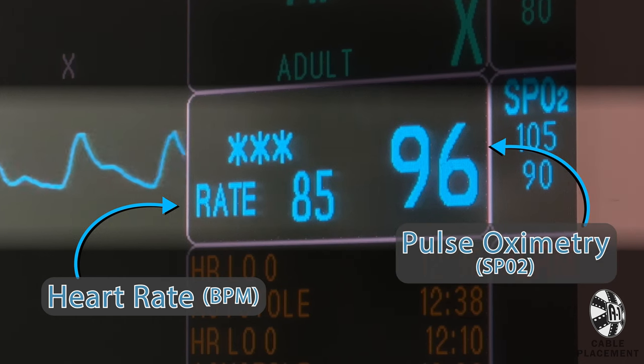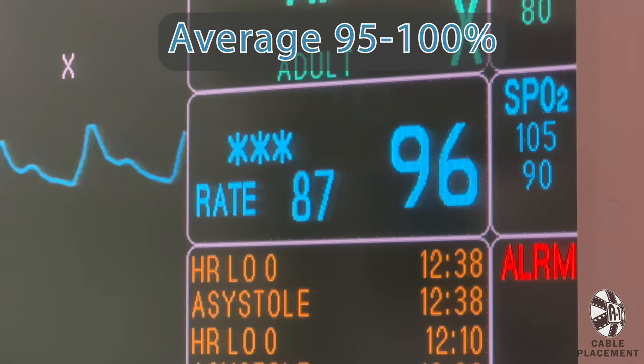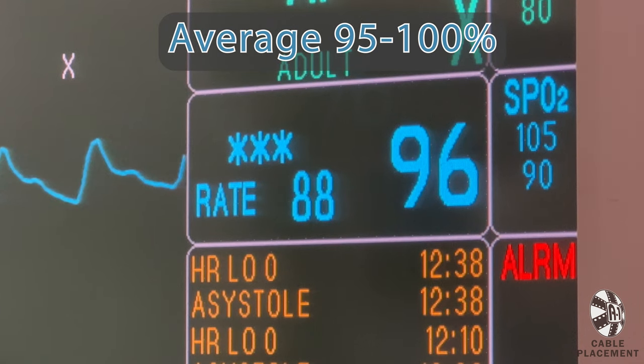The pulse ox is the percentage of oxygen in the blood. Anywhere between 95-100% is a healthy, average resting pulse ox.